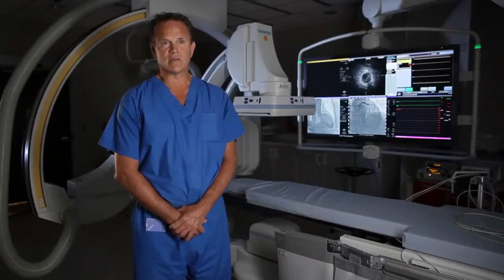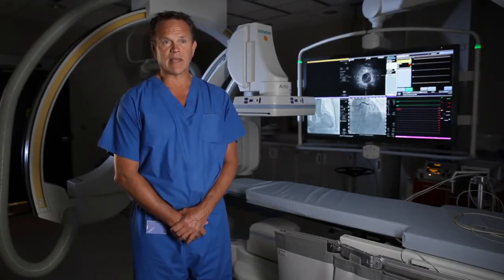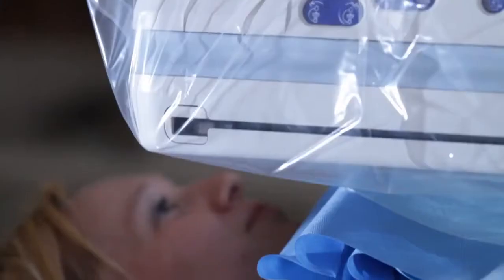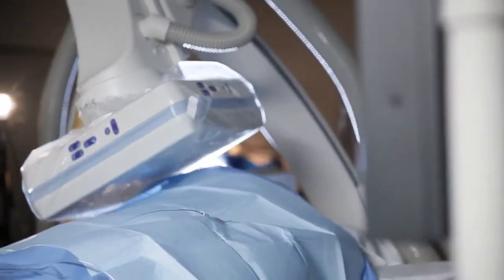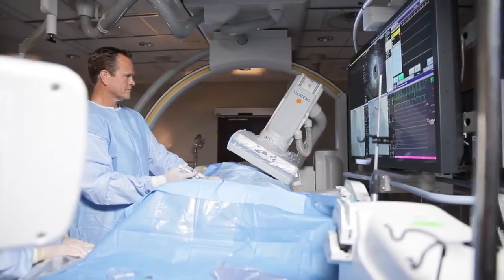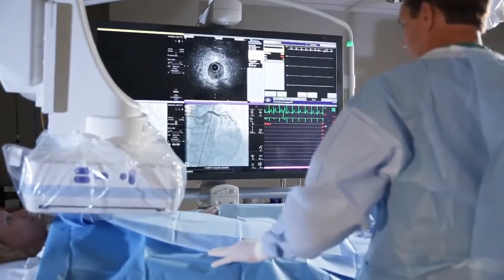It is a much safer way of doing the procedure than through the leg because the risk of any serious bleeding has been eliminated going through the small artery. It's also a much more patient-friendly way because you don't have the discomfort of pressing on the groin, and patients don't have to lay flat after the procedure is done.